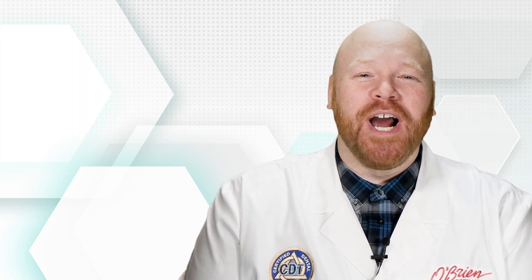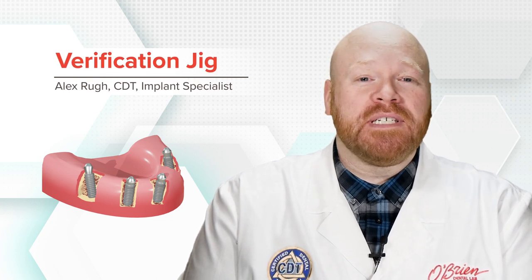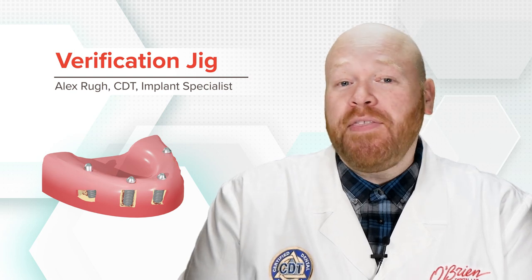Hey everyone, Alex from O'Brien here. When creating a restoration that will tie multiple implants together, it's important to verify the positional accuracy of the implant replicas in our MasterCast. And the way we do this is with a verification jig.